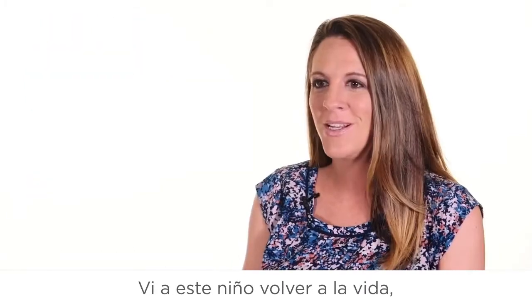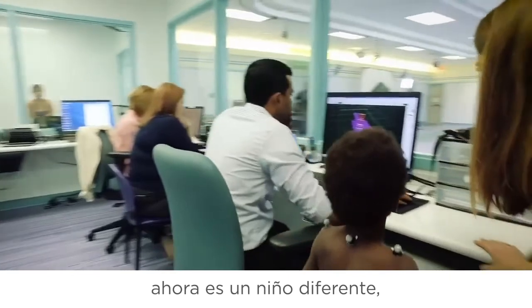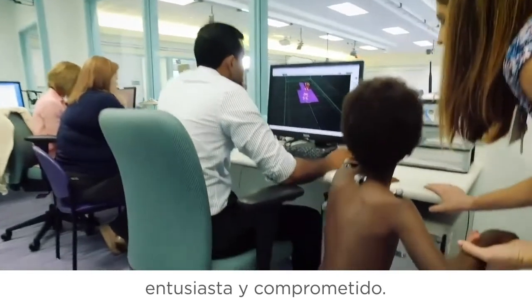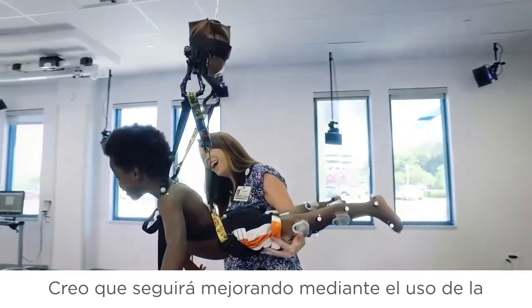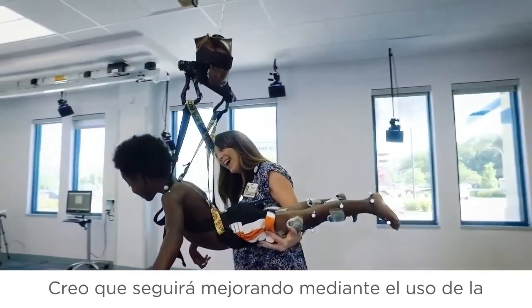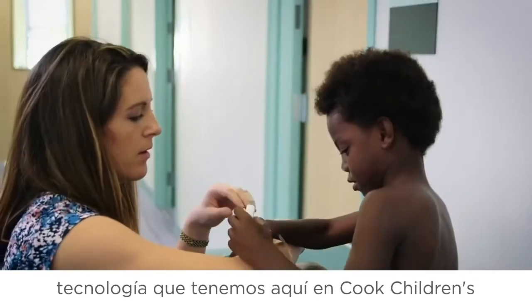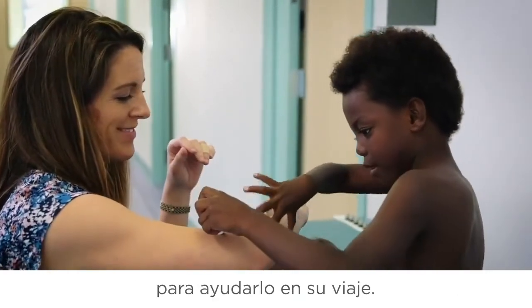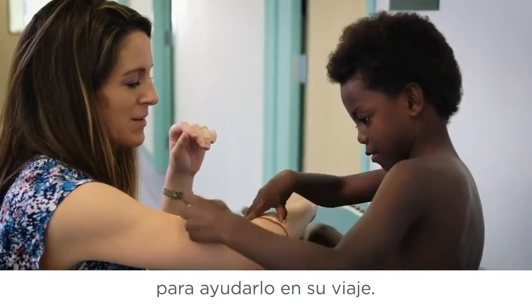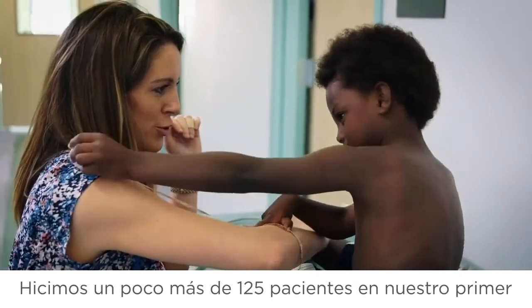I witnessed a little boy just come to life. Now he's just a different child. He's excited and engaged. I think that will only continue by using the technology that we have here at Cook Children's to help him along his journey.